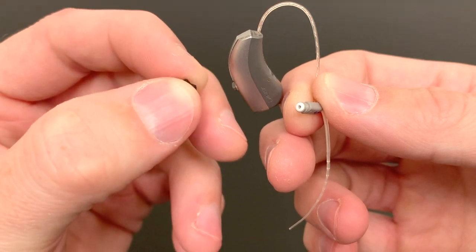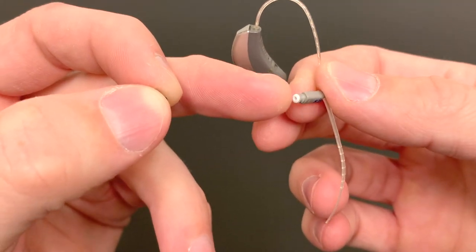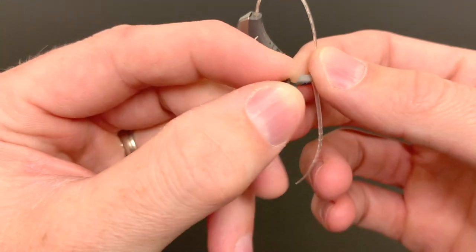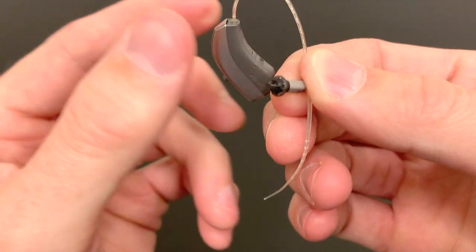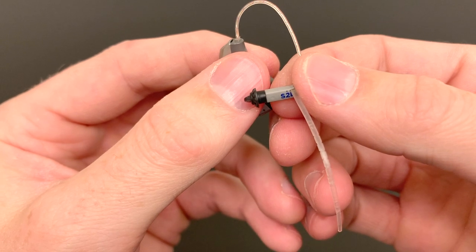So again, let's review the parts of the hearing aid one more time. This white piece here is called the wax guard. The rubber tip that goes on the end can be called a tip or a dome, and they come in various shapes and sizes.